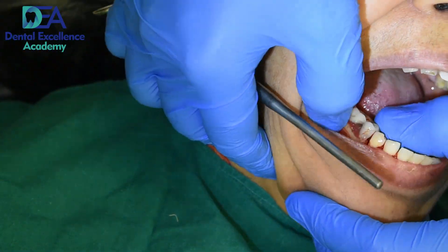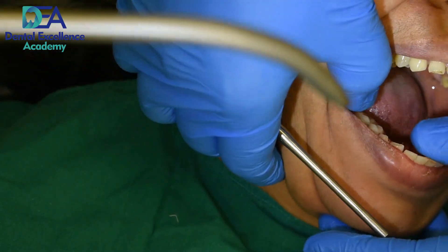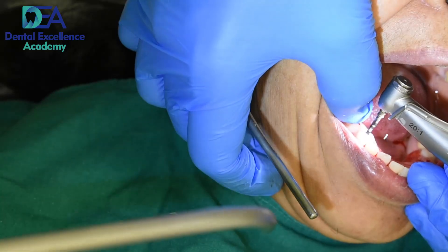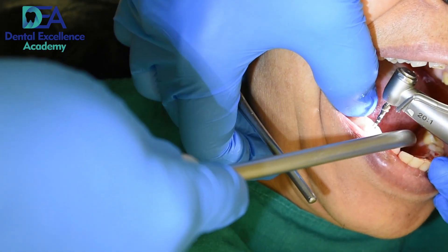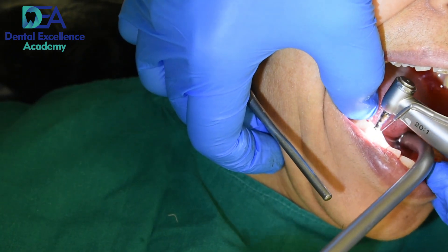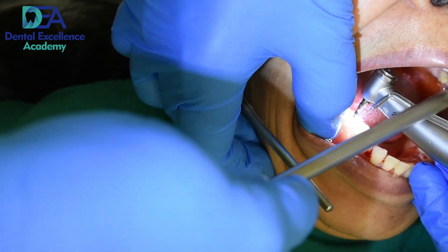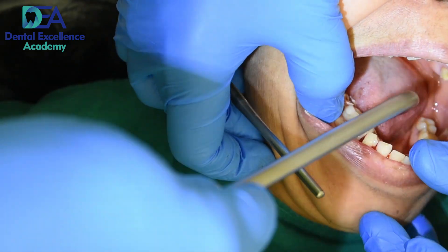We can hold it in place and start with the lancet drill to get the exact position of the implant. Now I am starting the osteotomy in the region of 46. It is just to get the idea of positioning.